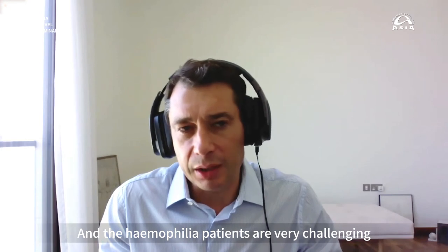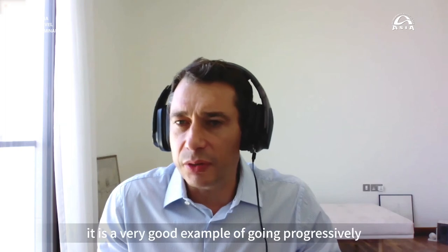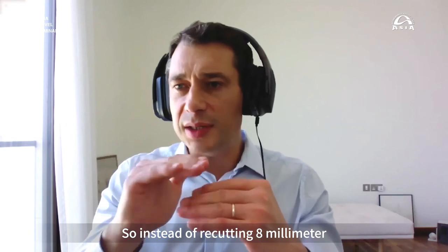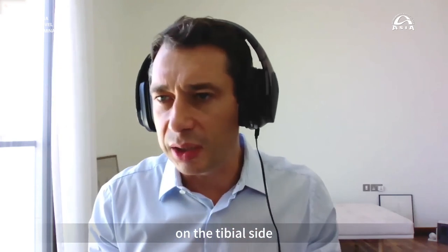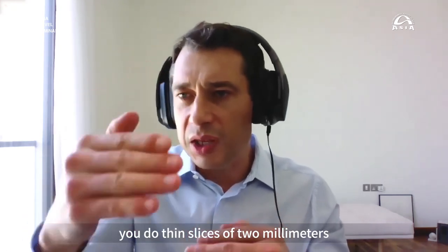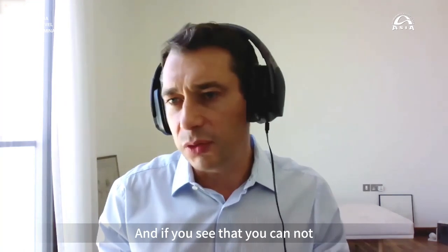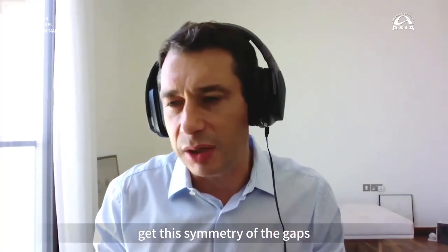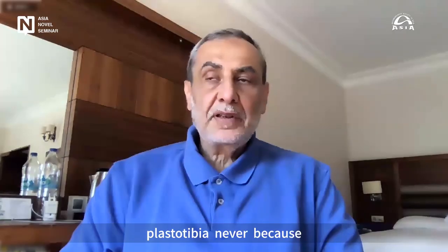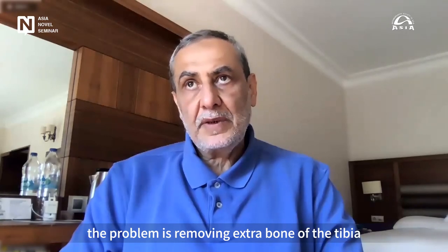And hemophilic patients are very challenging. Once again, it's a very good example of going progressively. So instead of recutting 8 millimeters on the tibial side, I would do exactly what I was saying for the femur. Basically you do thin slices of 2 millimeters, 2 millimeters, up to reaching your point. And if you see that you can't get symmetry of the gaps, then you have to go for a more constrained implant.